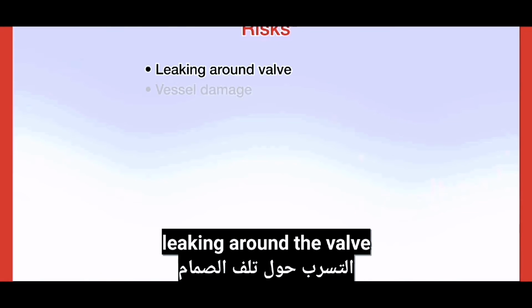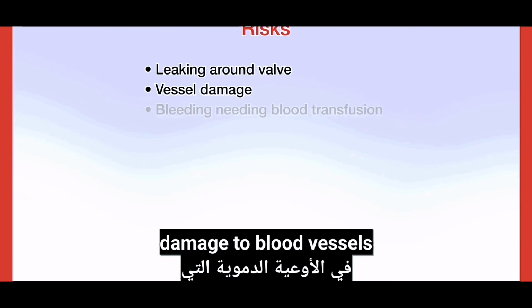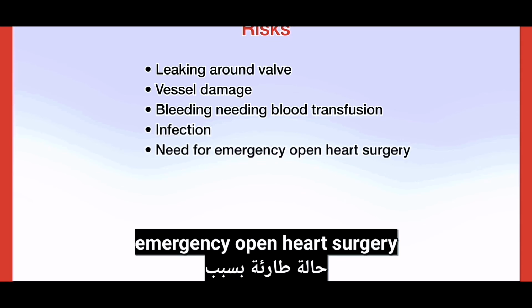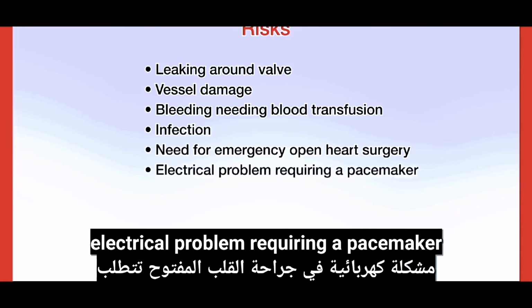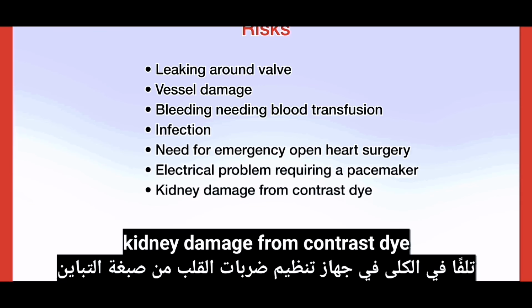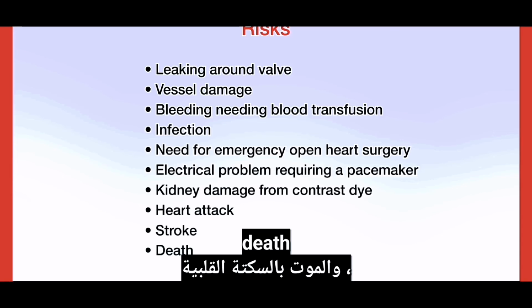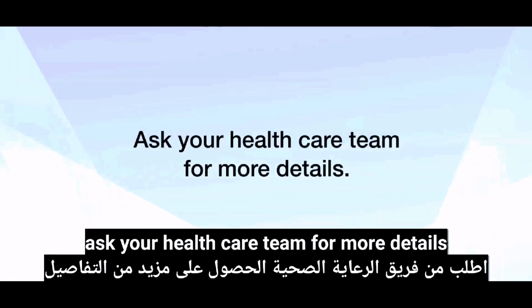Leaking around the valve, damage to blood vessels, bleeding needing a blood transfusion, infection, emergency open heart surgery, electrical problem requiring a pacemaker, kidney damage from contrast dye, heart attack, stroke, death. Ask your healthcare team for more details.